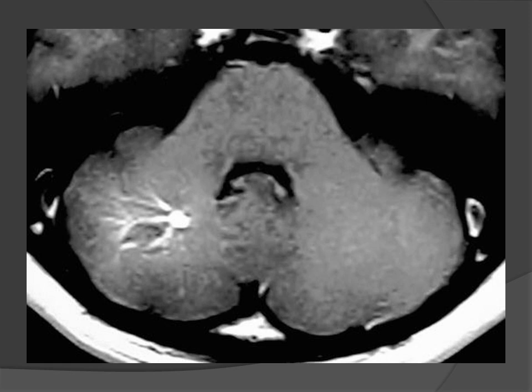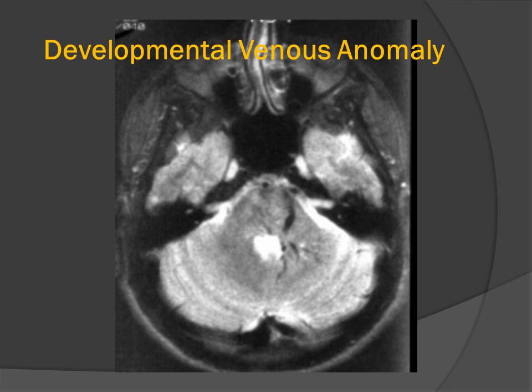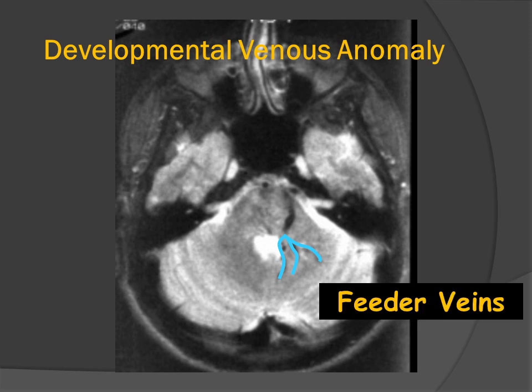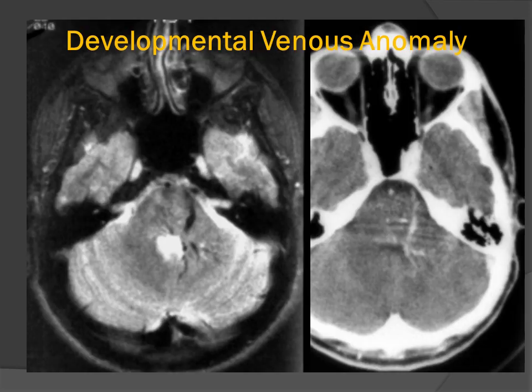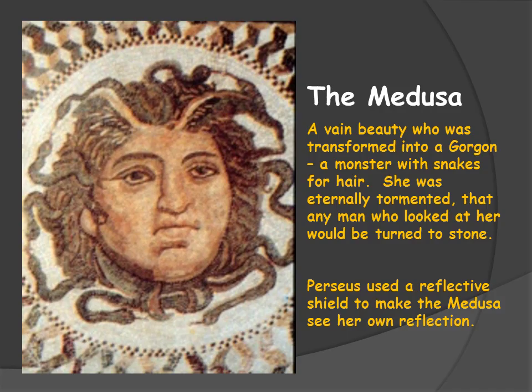Here is a posterior fossa developmental venous anomaly. We can clearly see multiple collector veins draining onto the head of a dominant transcortical or transmantal vein. Here is another posterior fossa DVA — again, multiple collector veins collecting onto the dominant transcortical vein. We may see these lesions on MR as flow voids, on CT as areas of increased attenuation, and there may be enhancement on both MR and CT. But it is the morphologic appearance of smaller veins collecting on a dominant transcortical trunk that is highly characteristic of the developmental venous anomaly.